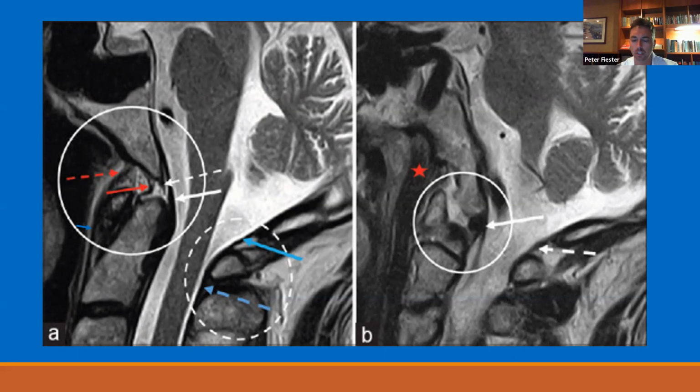You know, just anecdotally, I've seen ligaments that are clearly torn. You get externally braced or supported, and the ligament never really goes back to normal imaging-wise. It becomes a more dark, amorphous signal that fills in that area. I suspect there's some kind of granulation tissue or maybe some mild ligamentous healing that occurs, but I'm not sure. It's never really returned to how it looks pre-trauma, but that hasn't been studied as far as I'm aware.